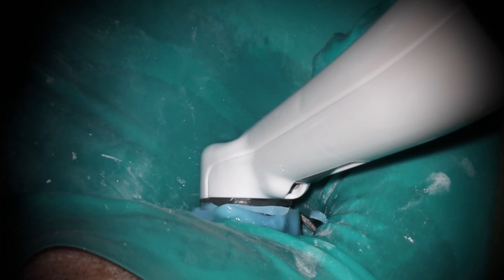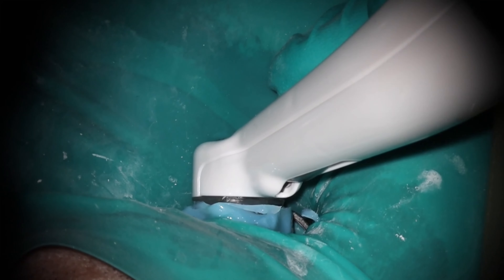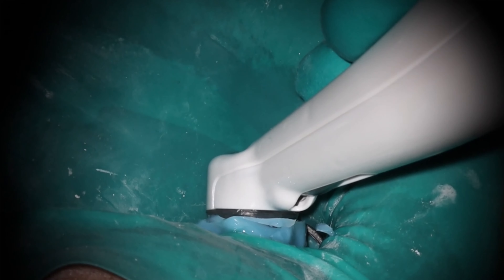When you get good at platform building, you should be able to hold the unit with one finger. I've actually done it where there's so much suction that if you drape it properly, it will suction and hold on to the tooth itself — which is really cool. You still want to be in there in case the patient moves. I actually started off holding it with my left hand and was able to do my entire note with my right hand while this was running. I cannot say enough good things about this new clean flow handpiece — it is so much better than any of the other ones they've come out with.